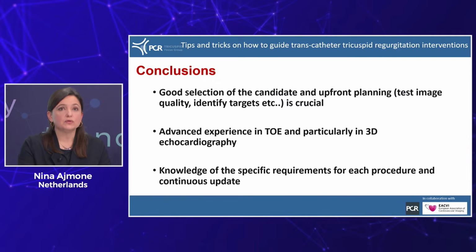So in conclusion, I'm very happy to repeat some of the important messages of the talk, because for us they are really, really important. The selection of the candidate and upfront planning is really crucial, and for that we need an experienced imager that really masters also 3D echocardiography and then knows all the specific requirements for each of these procedures.